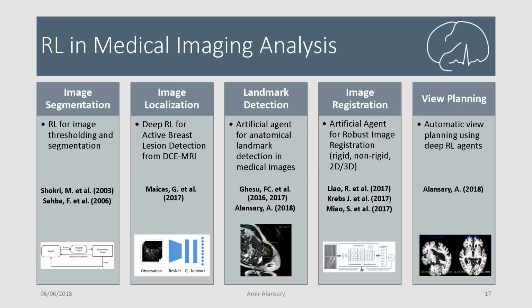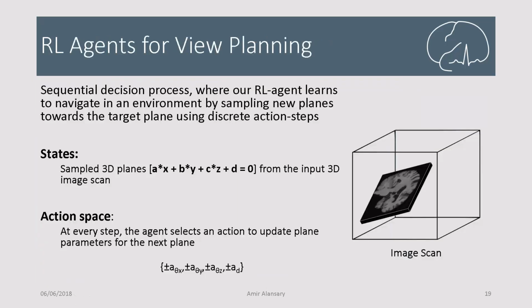These are the applications that applied reinforcement learning in medical imaging. You can see most of our applications: segmentation, localization, landmark detection, image registration, and view planning, which is this work, which we will explain now. So now the second part is the view planning, how we apply this.